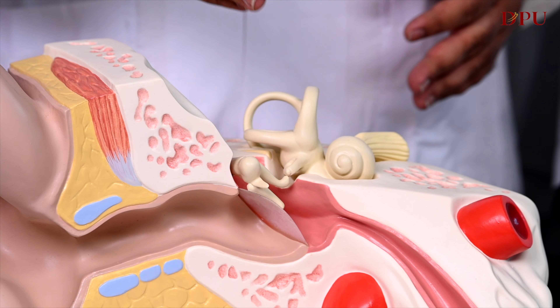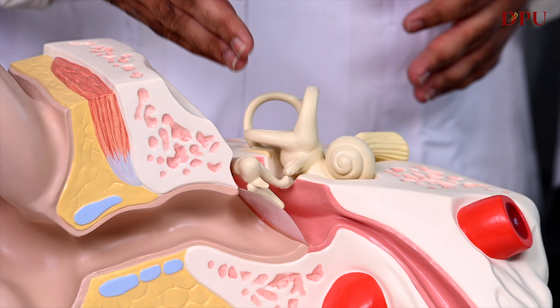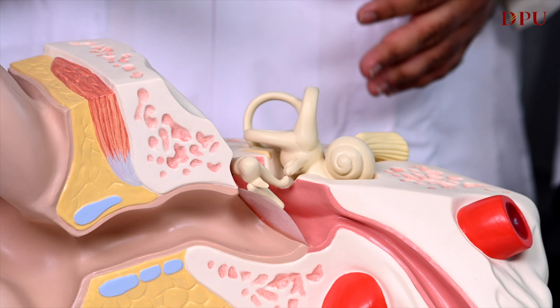Now, the aditus part combines with the posterior region of the temporal bone, where there is a pneumatization of the bone. This is the main region where we will be focusing during our temporal bone dissection.